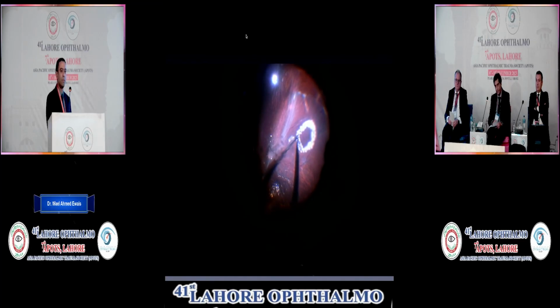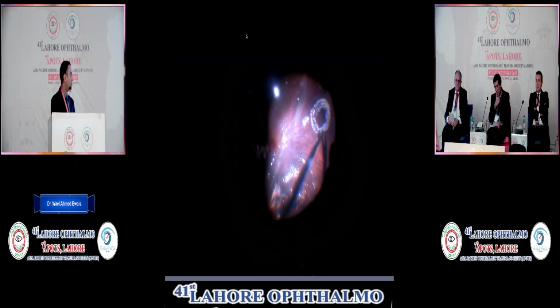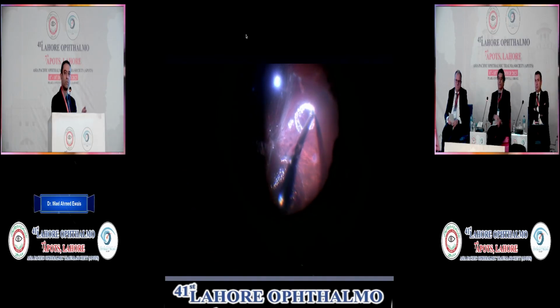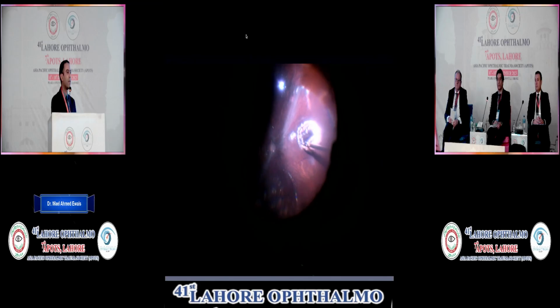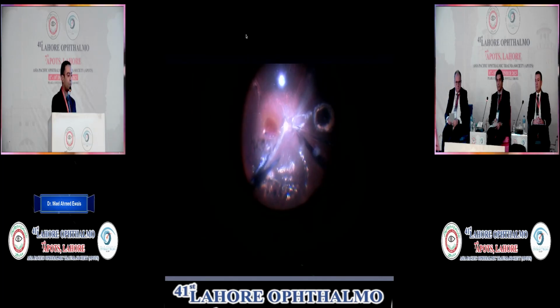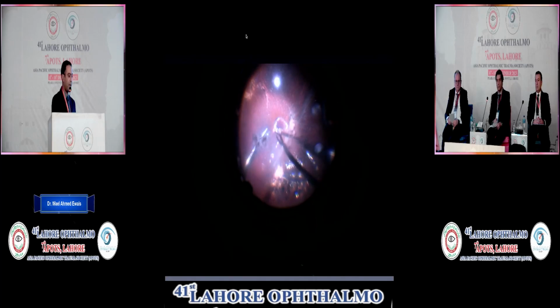But I had a problem in the case. No part of the retina is healthy enough to retrieve a graft in this case. The area that was close to the retinal fold, to me in this situation, seemed to be the relatively healthiest of all, because all the other parts of the retina were unhealthy. There was scattered laser performed in the other parts that were attached in the retina. And so I had to choose between the least of the bad choices that I have.